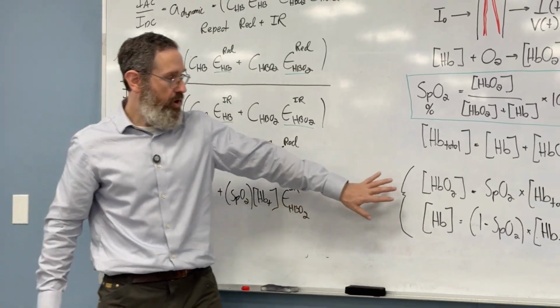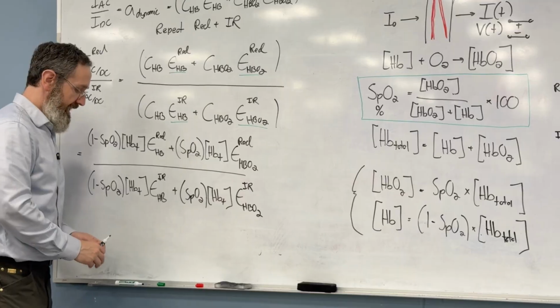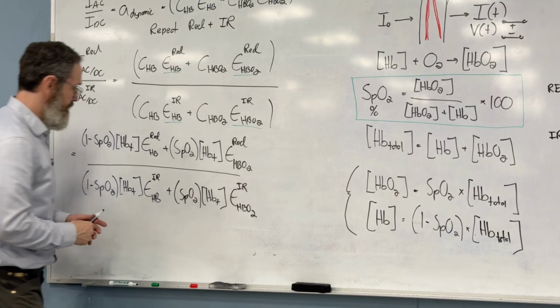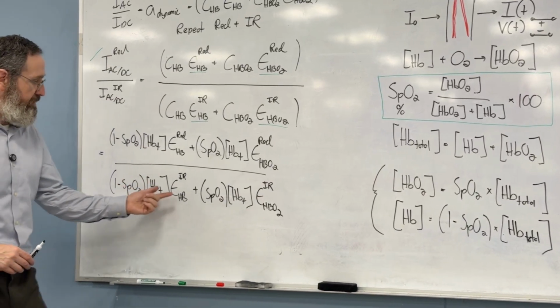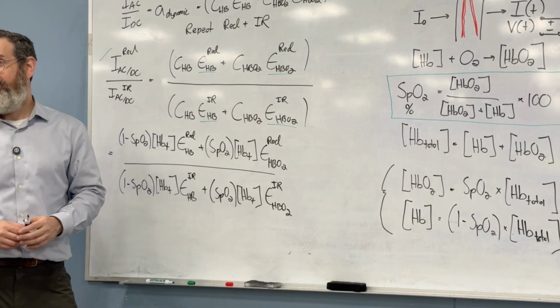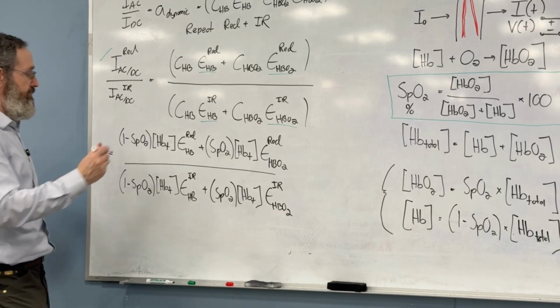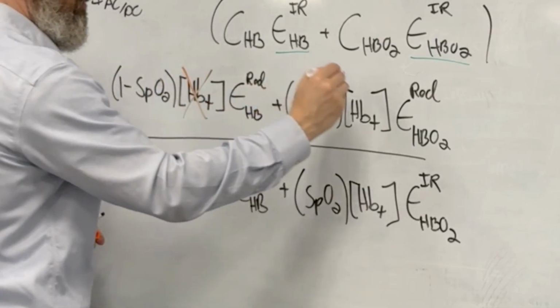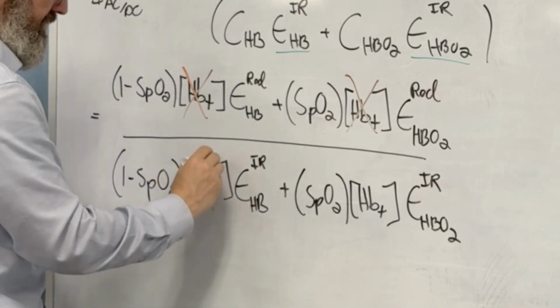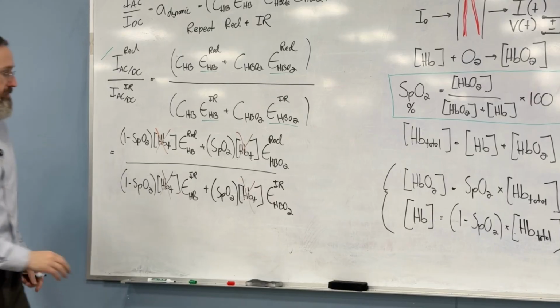This was an odd expression. It really is odd until we suddenly plug it in here, and then something happens. Hb total, Hb total, Hb total, and Hb total cancel out, and that's the trick. So what I can do now, let me get a little orange, is we're going to take this out, this out, this out, this out. Let's erase it.